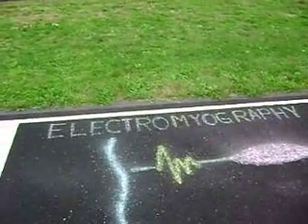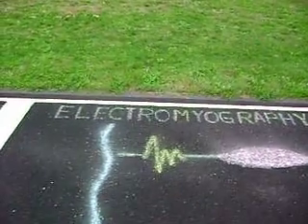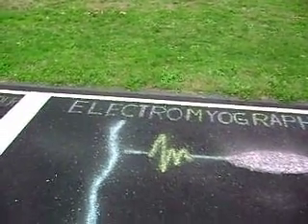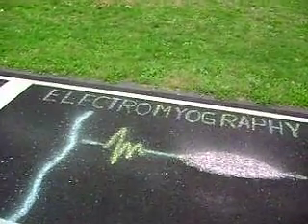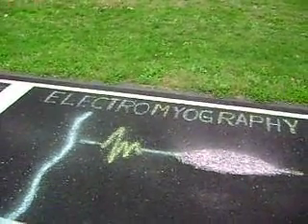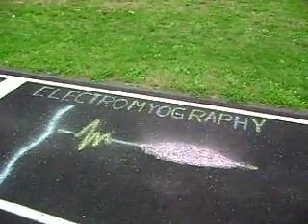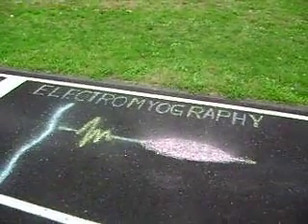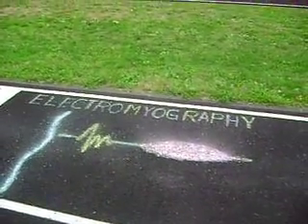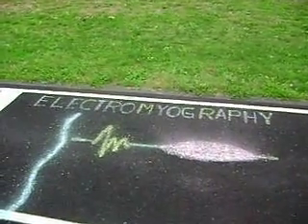The H wave is a muscle action potential resulting from submaximal stimulation of a monosynaptic reflex arc with the large diameter sensory nerves as afferents. Because of practical and anatomic considerations, the tibial H reflex, dorsal and ventral roots of the first sacral nerve, S1, is the only one typically recorded.